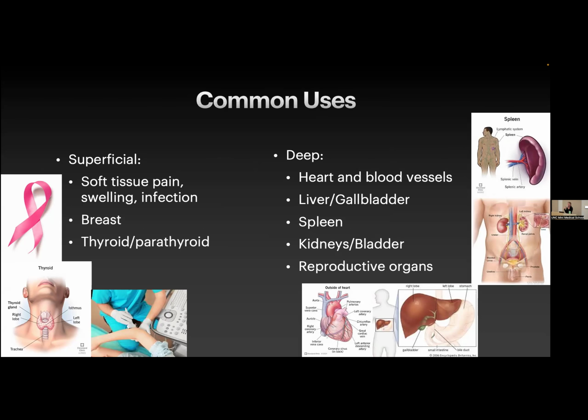And in the abdominal world, I use it for evaluating the thyroid and the parathyroid. So that's the one area above the diaphragm that I also do, is just in the neck. We skip the chest. And seeing, is there a thyroid nodule that needs to be biopsied? Or is there a parathyroid nodule that might explain why your calcium level is really elevated or really low?